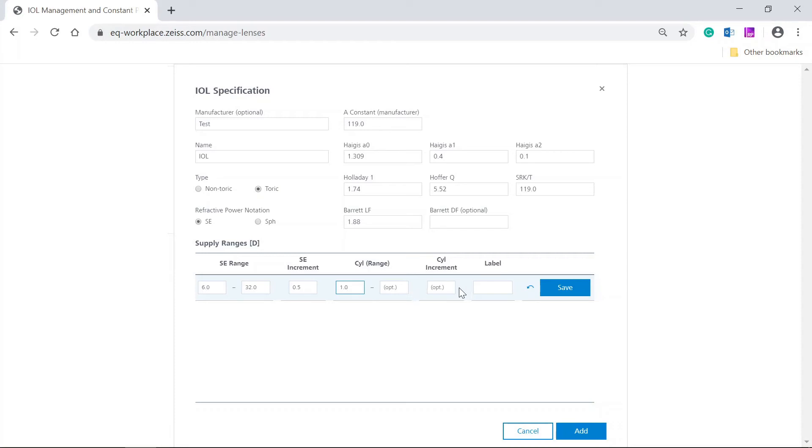In the label field, type in the name, for example, T2. If the IOL does not have specific labels, you can leave the label field empty. Then, click on save.